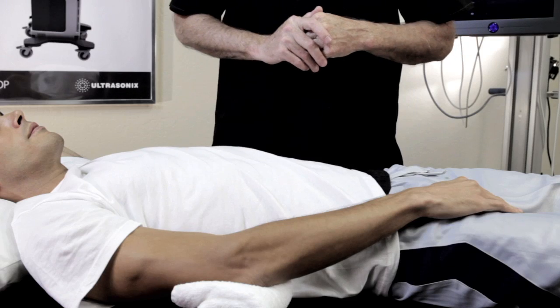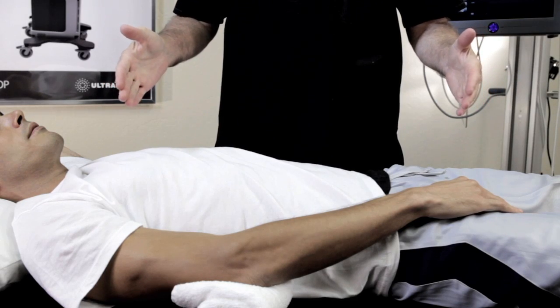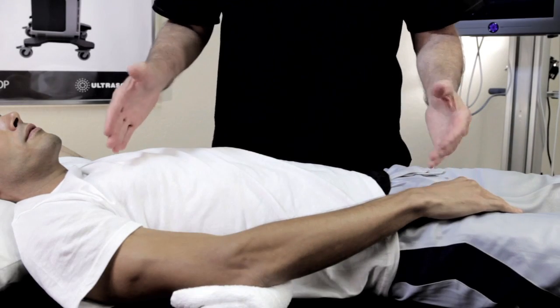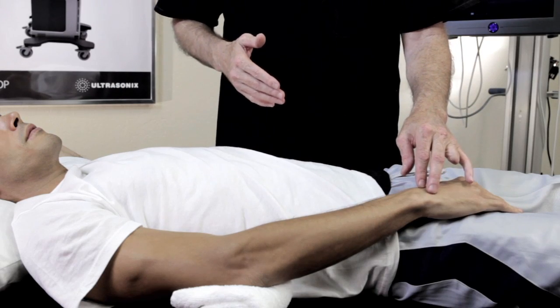Patient positioning for most of the elbow examination is the patient supine on the table with a soft towel or bolus underneath the elbow. This raises it up for better probe manipulation, with a slight flexion of the elbow to look at the lateral epicondyle.